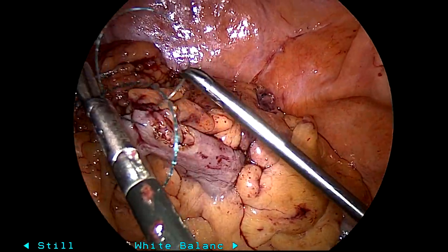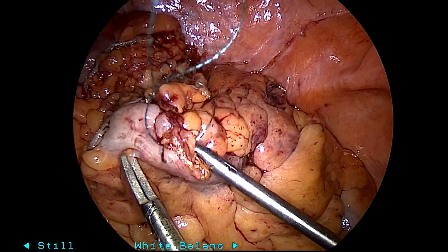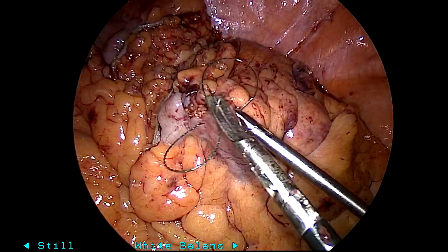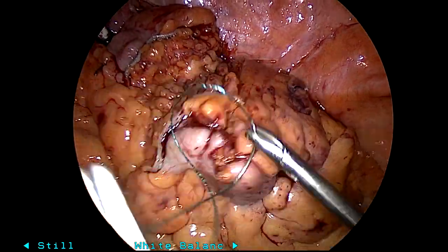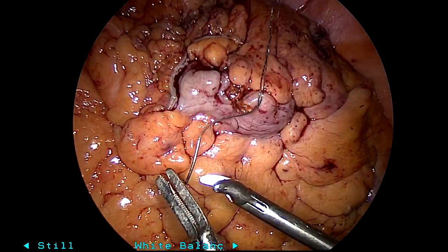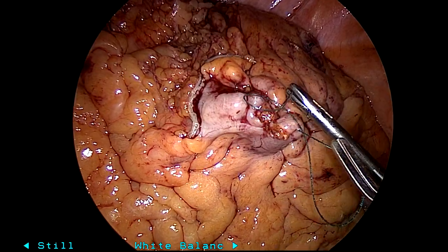I think the benefit of the intracorporeal anvil placement in this patient — BMI close to 60 — is that not having to pull the colon through the abdominal wall would have been difficult at the Pfannenstiel location. So you don't need as much length on the bowel, and I didn't want to make an incision anywhere higher up in the abdomen that would be at higher risk for hernia. That's why I'm doing what you're seeing here.